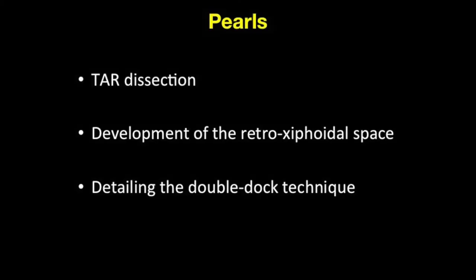In this video, we will highlight TAR dissection. We will also detail the development of the retroxiphoidal space to ensure adequate cephalad overlap. We will also discuss and highlight the logistics of the double-dock technique.